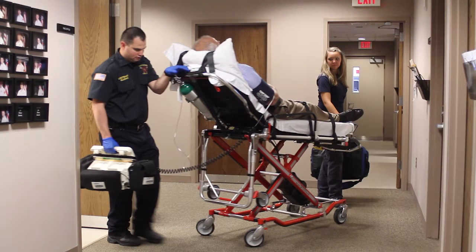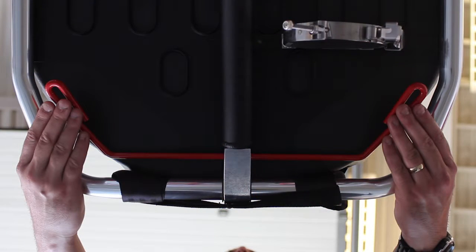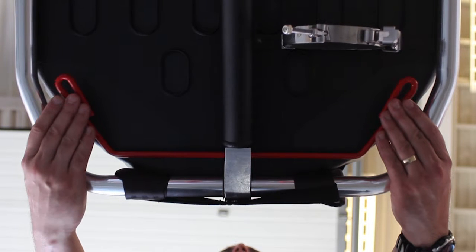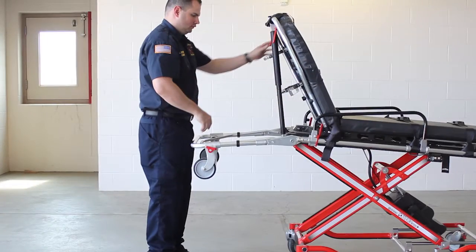The backrest elevates the patient's torso for comfort and medical necessity. To raise or lower the patient's upper torso, press the red control handle toward the backrest to unlock it and then raise or lower the backrest to the desired position. Release the control handle to lock the backrest in place.